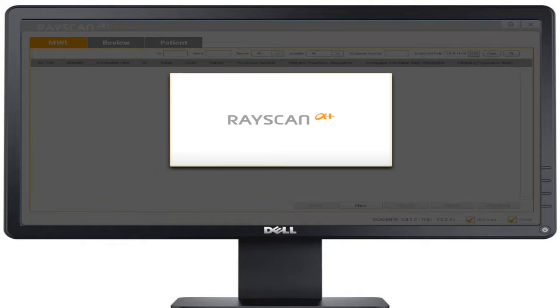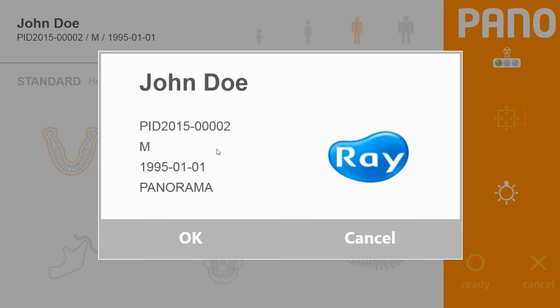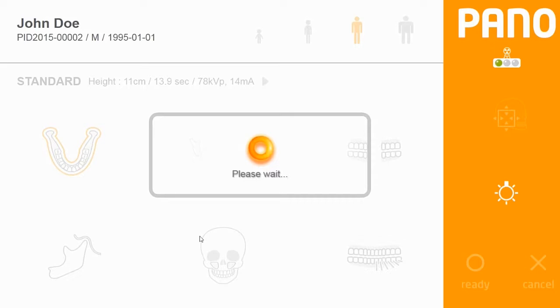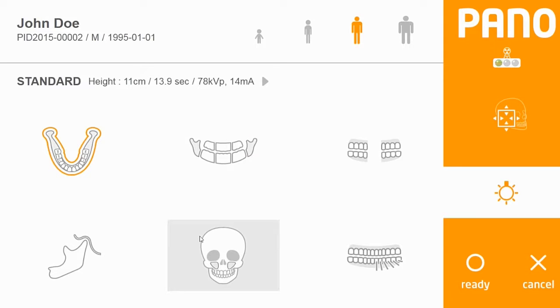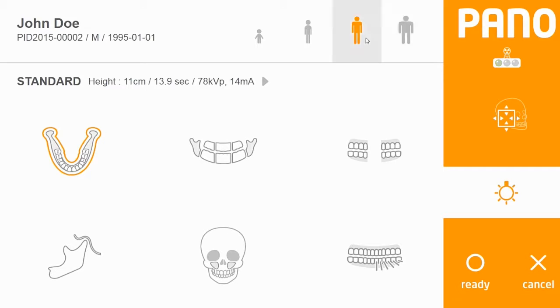Set up the acquisition from within your imaging software. The first screen is patient information — simply click OK. You will notice the machine is initializing itself for you, so you don't need to click reset after the previous acquisition. The interface includes options for patient type, from a child setting to small, medium, or large adult. The default is medium adult patient once you enter the interface.